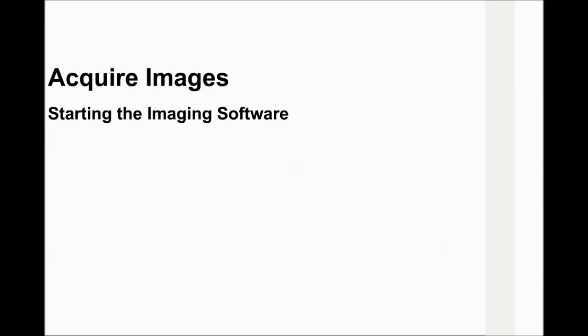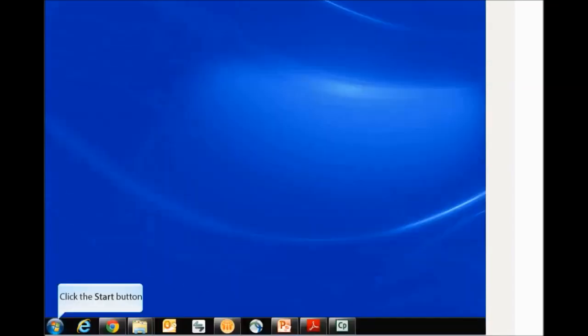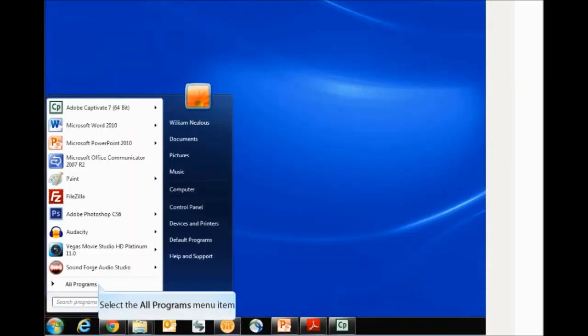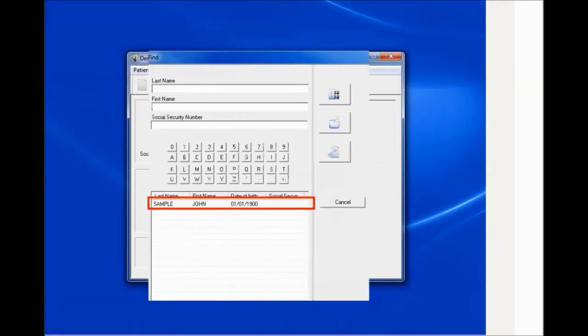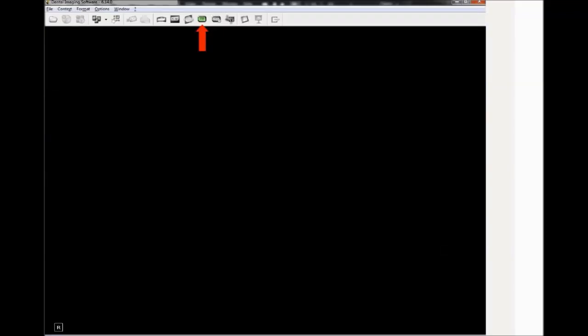Acquiring Images. Starting the imaging software: on your desktop, double-click the imaging software icon or click Start > All Programs > Dental Imaging Software. Create or open an existing patient record and access the imaging window from the patient file. The CS7200 icon is displayed in the imaging window toolbar, indicating that the scanner is connected to the workstation and is ready for acquisition.